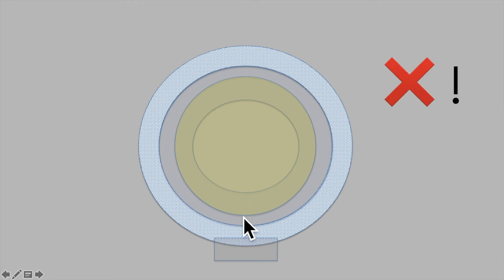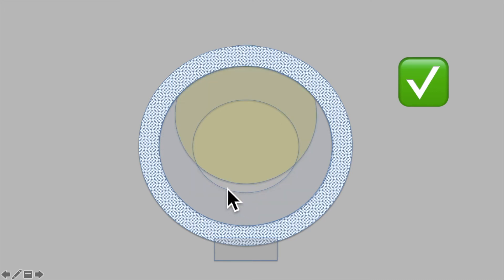The thing absolutely not to do is to try and get under the optic edge through the anterior capsule here. If you press down through the anterior capsule, that can lead to a zonular dialysis — definitely to be avoided. The correct approach is to nudge the lens forwards while sliding the rhexis edge posteriorly to get into the little gap between the optic and the rhexis edge, over the viscoelastic which is still in the capsular bag at this point.